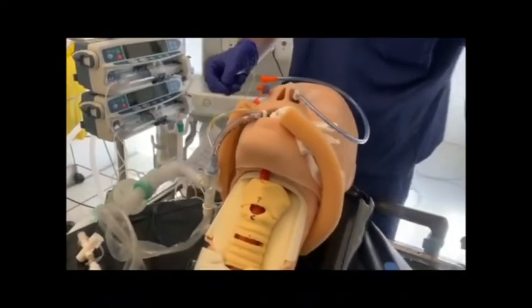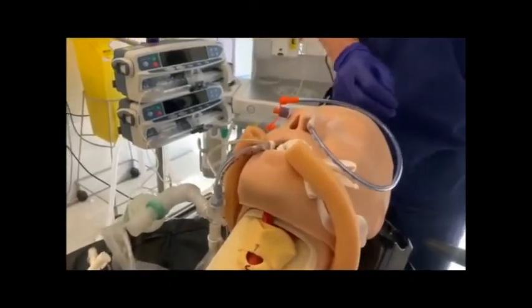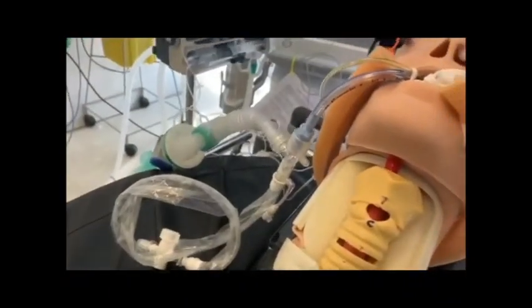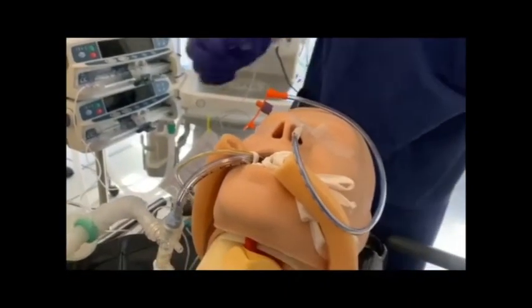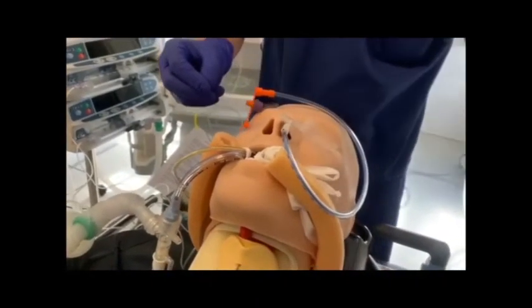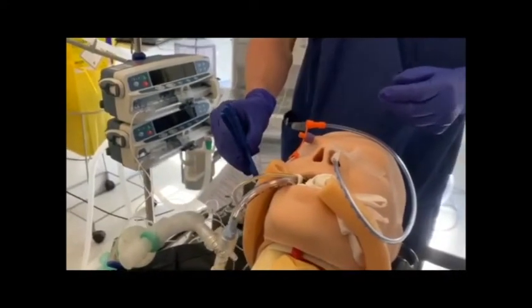Once the patient is fully sedated and paralyzed, you undertake suctioning: oropharyngeal suctioning, aspiration of the subglottic port, inline suctioning, and also aspiration of the nasogastric tube. You need to exchange the existing tube ties for some tape to allow easy withdrawal of the tube during the procedure. And you need to have available 2 clamps for clamping the ET tube, also required during the procedure.